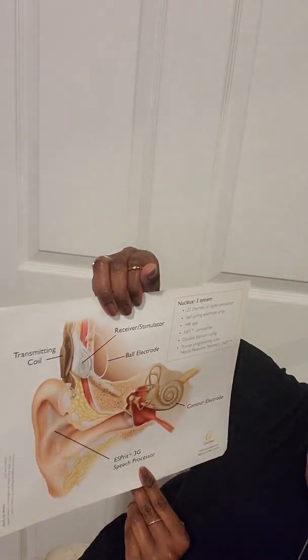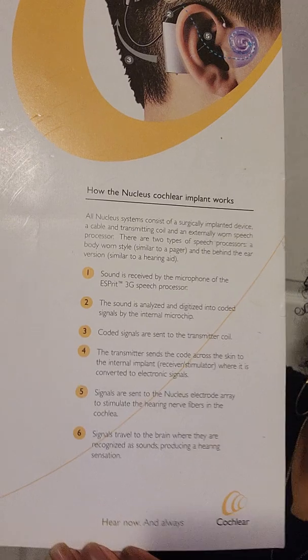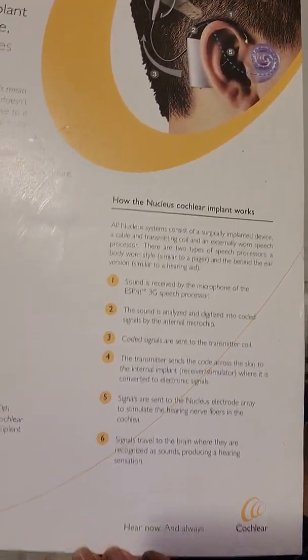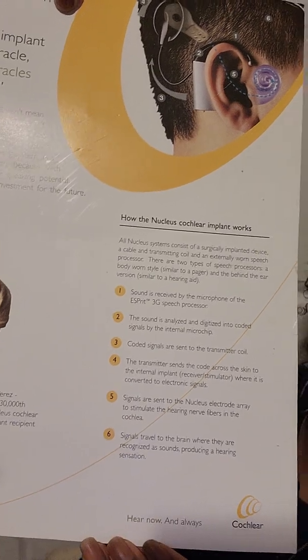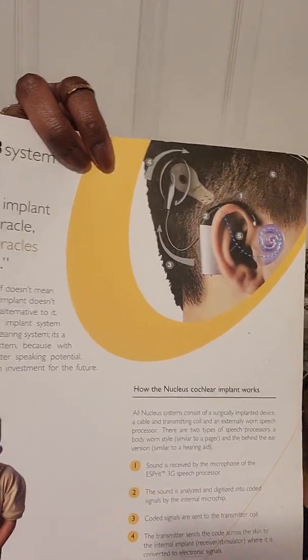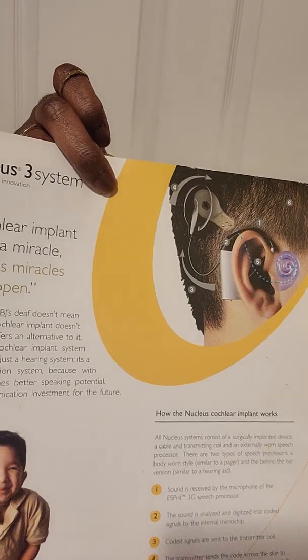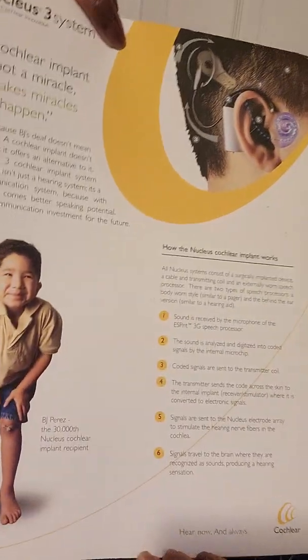So there's another page in which they explain how cochlear works. So this is it right here. And I'm just gonna hold this up so you guys can see. Again, if you would like to learn more about how this works, I would really encourage you to do your research, because it's just a lot to explain. It's very scientific. It gets very technical. So this is the cochlear implant. That's what it looks like in that picture. That's what my first cochlear implant looked like. It looked very similar to a hearing aid.